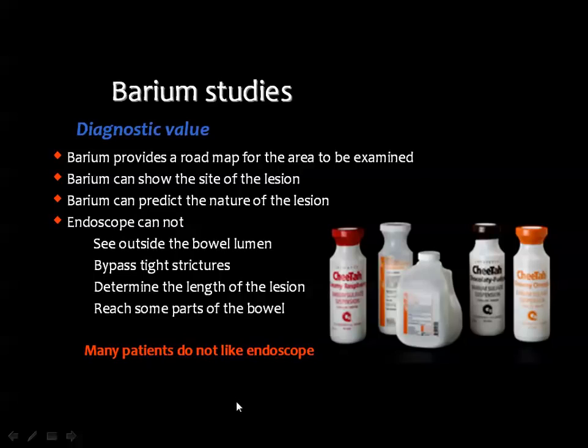Then we should know some issues about the use of barium. Its use has markedly regressed in clinical and diagnostic purposes because of the widespread use of endoscopy, as well as the availability of many techniques that can be performed using modern CT machines.